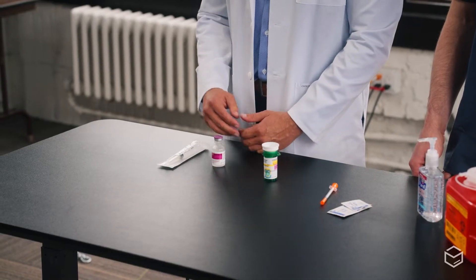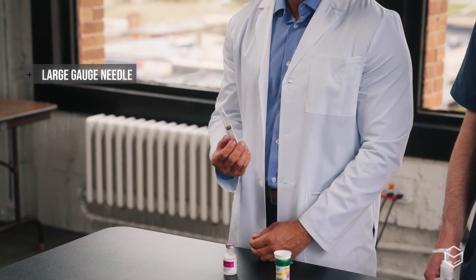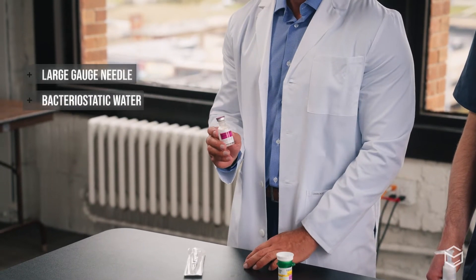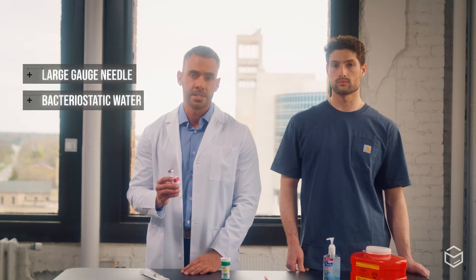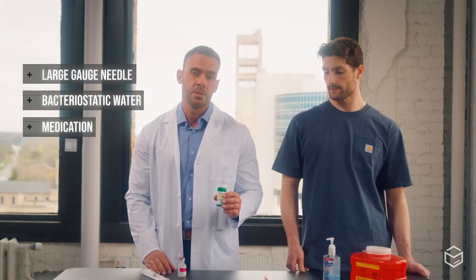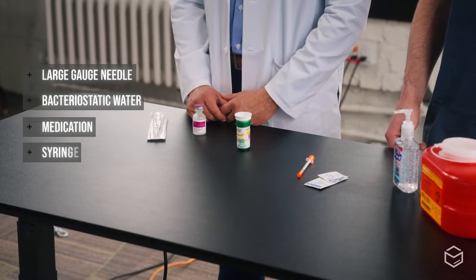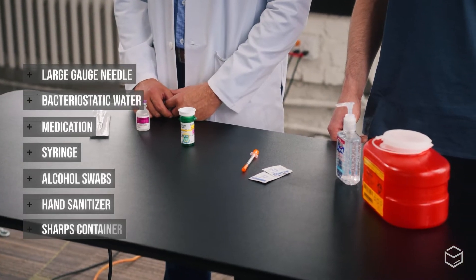To do this, we're going to need a few different supplies: a large gauge needle to draw up the bacteriostatic water and mix it into the product; the bacteriostatic water, which helps prevent bacteria from entering your solution; the medication — today that's BPC-157, a very useful healing peptide; the syringe to inject it with; alcohol swabs; something to clean your hands; and your sharps container.